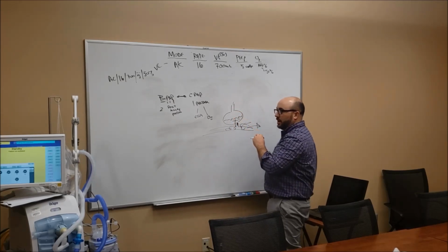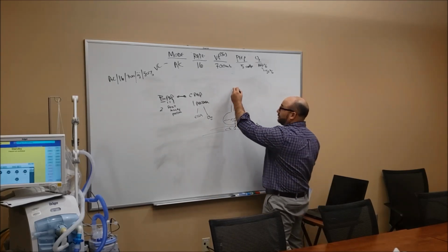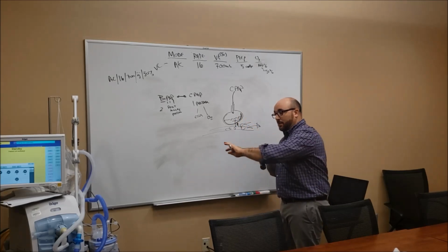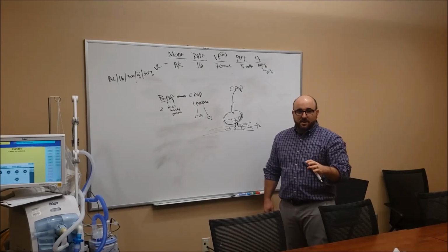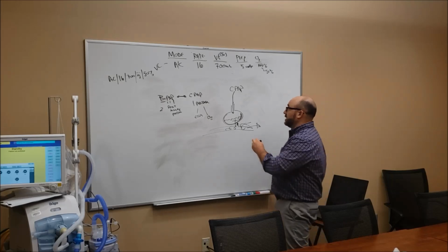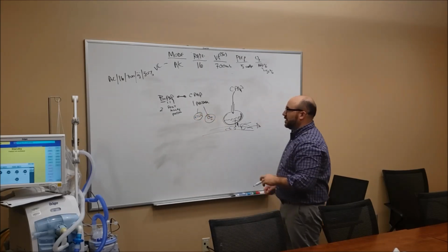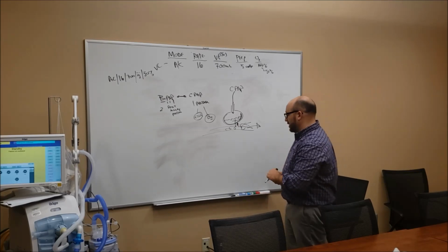We give extra oxygen going here. The one thing that helps a lot, which we don't see done a lot, is giving CPAP. You add that continuous positive airway pressure, it goes in here, it pushes this fluid, and actually offsets that pressure and pushes the fluid into the bloodstream, so it makes your diuretics work even faster. It can be used in the ER, and sometimes is, but using CPAP to offset a straight fluid issue is really important. So OSA and oxygenation issues, usually with some kind of pulmonary edema related to congestive heart failure, are common for CPAP.